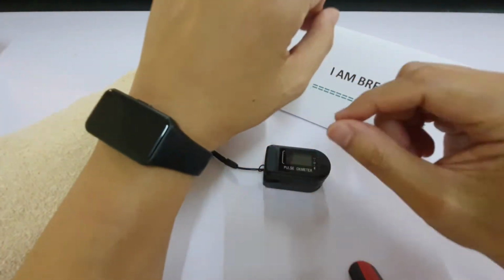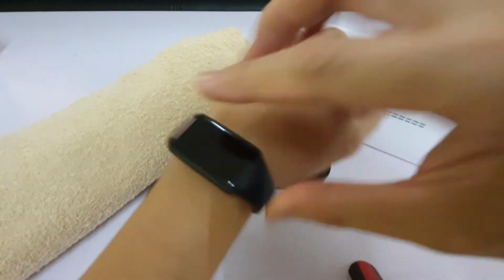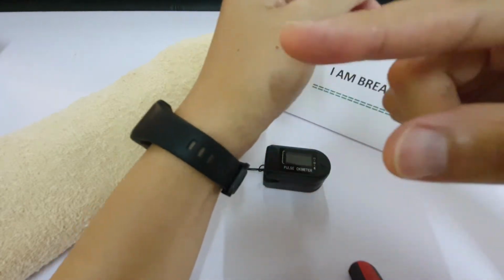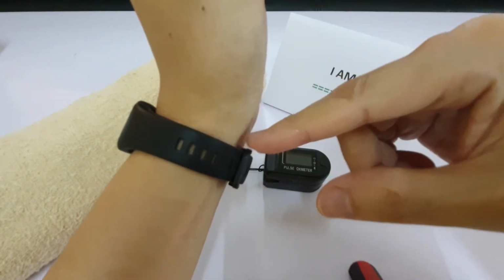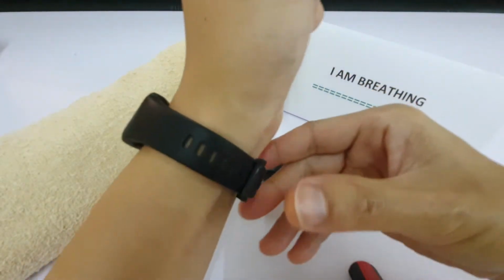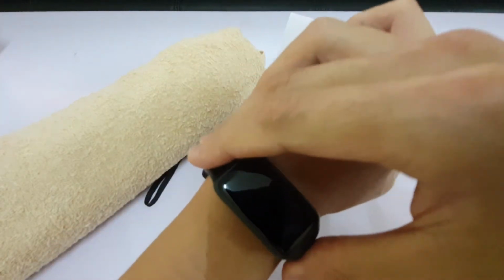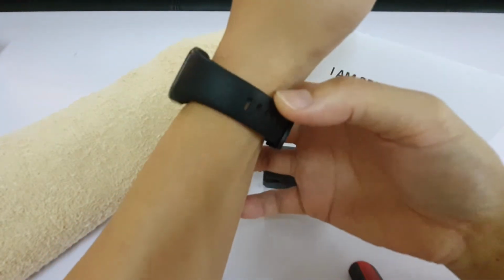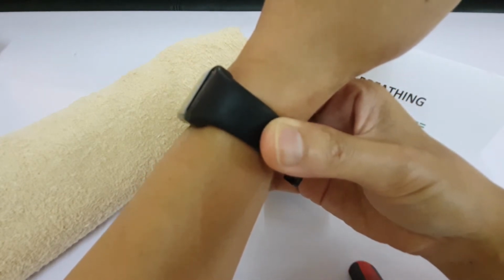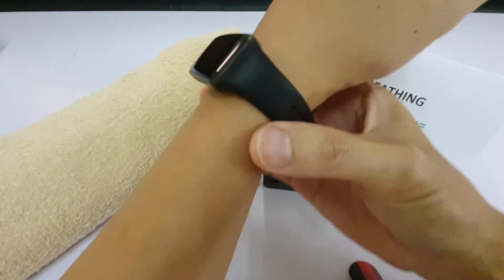Now this fitness band, and most modern fitness bands actually have SpO2 measurement. This is a very modern one. This is the Honor Band 6. Now I will tell you based on experience that the accuracy of the SpO2 really depends on how you wear it. For example, if you wear it loosely like this, most of the time it may not be very accurate. So you do need to wear it tight against your wrist, and then it would measure a lot more accurately than just having it loose.